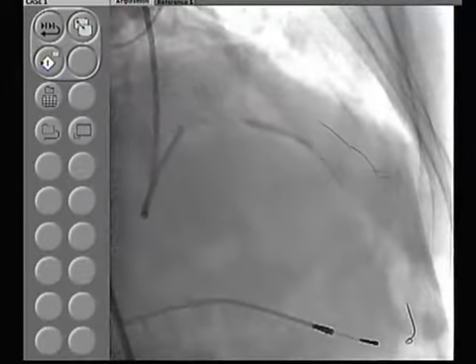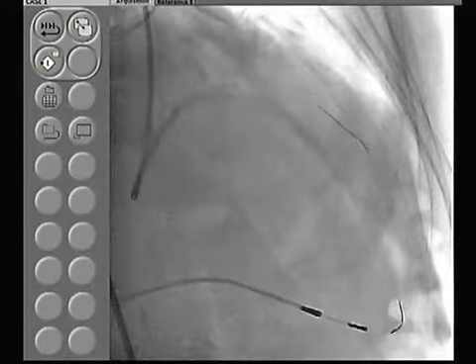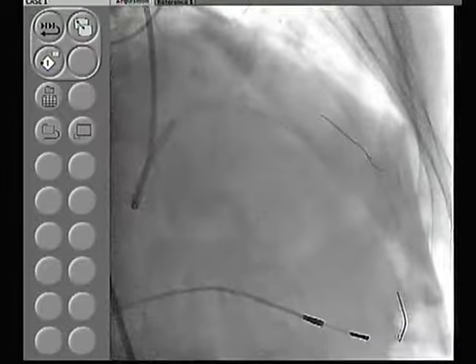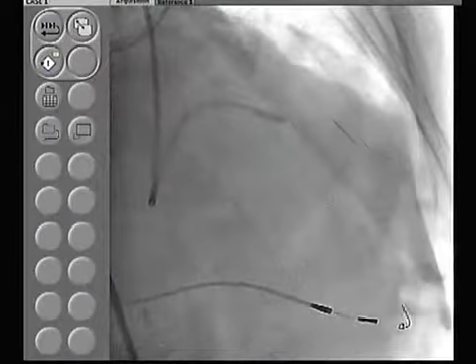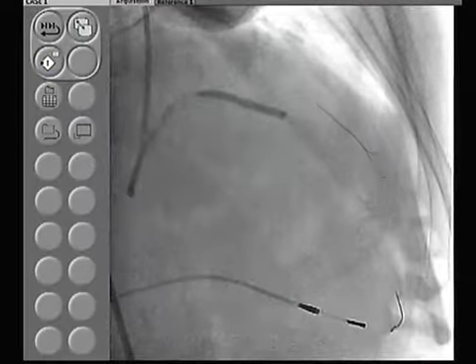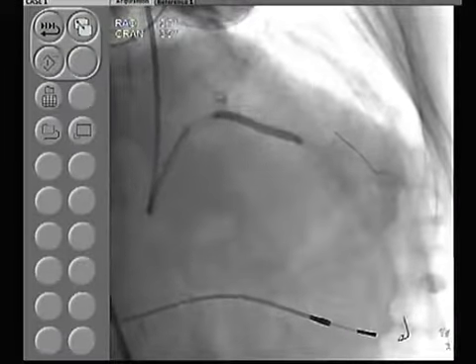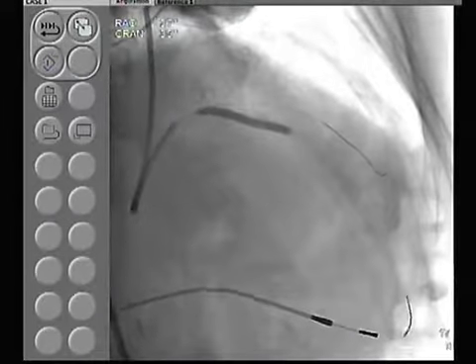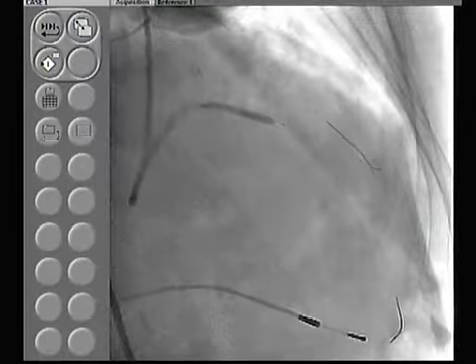I take pride in that maybe that is why in these complex cases we still have a proximal edge. Once you come out, you always open the proximal edge because you are going to put a second stent to funnel it up, knowing that the stent you deploy, the everolimus Xience or Promus, you deploy at a moderate pressure, otherwise you create a distal dissection. Proximally now, you can go to 14 atmospheres. We deployed that at about 12, and now the second stent will go. Before going into it, we'll take a picture and decide whether we put one additional stent in the diagonal, because that diagonal lesion will not be covered by a 28 millimeter stent.